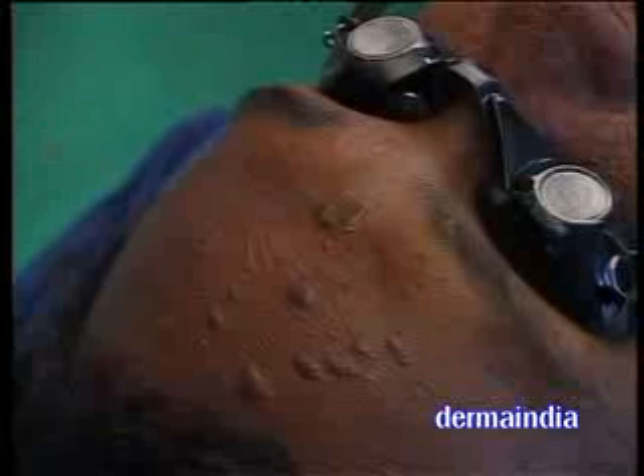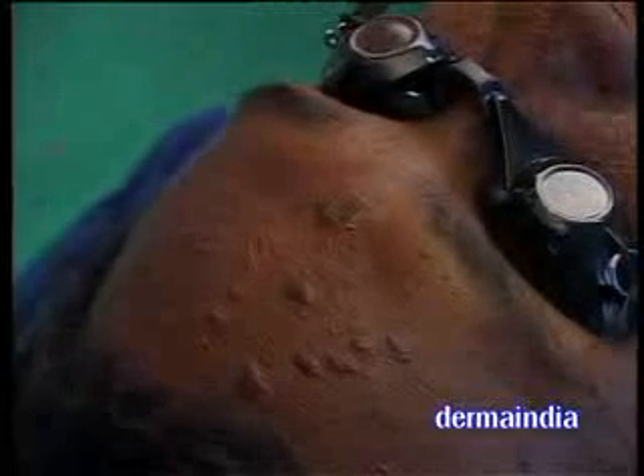The last is fractional mode. Size 10 into 10 — I am choosing the same size. The dot spacing I am choosing as 1.1 mm. Energy repeat — no repeat, so only one single shot. Energy 25 millijoules. There are 2 modes here — random and normal.